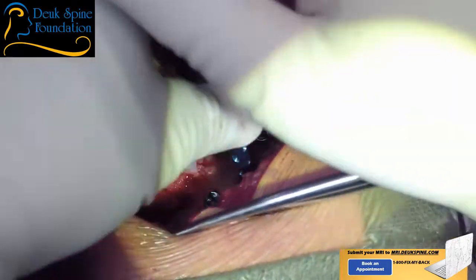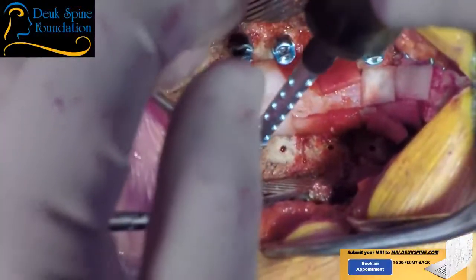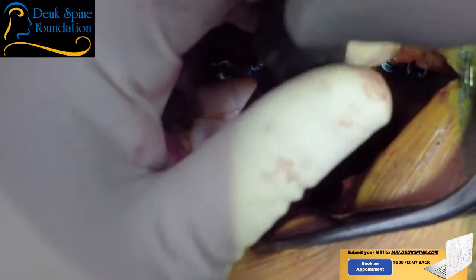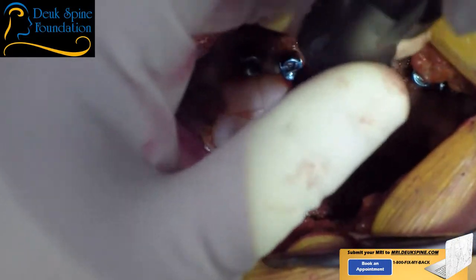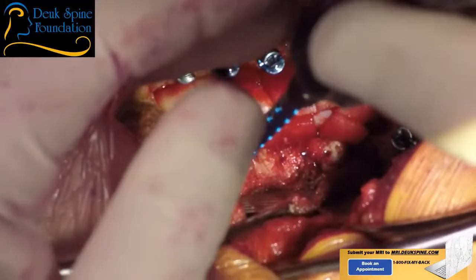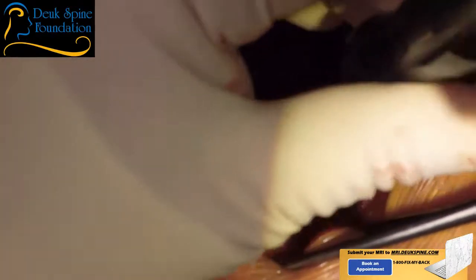I'm watching for C7. All right, so we're going to do a 14 up at C3. Now, once again, you don't absolutely have to put in every single segment. I don't think that's necessary, but if you don't get screws in the middle of the construct and fixate them to the rod, you get a phenomenon called snaking. That's where the spine will actually snake between the points of fixation at the ends.